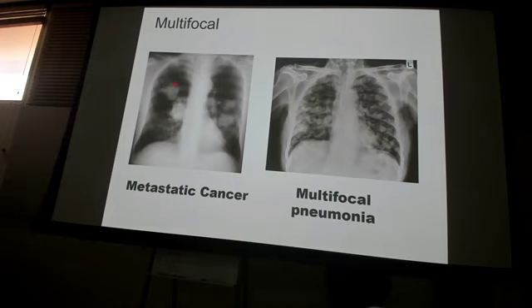Multifocal, right? So you see all these clear, distinct masses. These are all lung cancers that have metastasized. So it may not be primary lung cancer. It may have been somewhere else, metastasized to the lungs. You see all these. At our level in primary care, you wouldn't need to describe each individual one. You would just say multiple consolidations, unknown masses, bilateral lungs ranging in size from 2 centimeters to 5 centimeters, right?